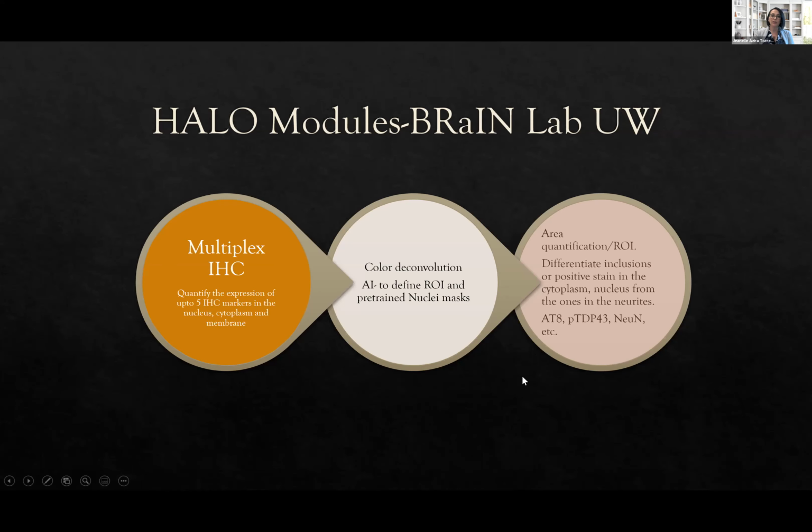analysis. So the modules that I'm going to talk about today include Multiplex IHC, which quantifies the expression of up to 5 immunohistochemistry markers in the nuclei, cytoplasm, and membrane.